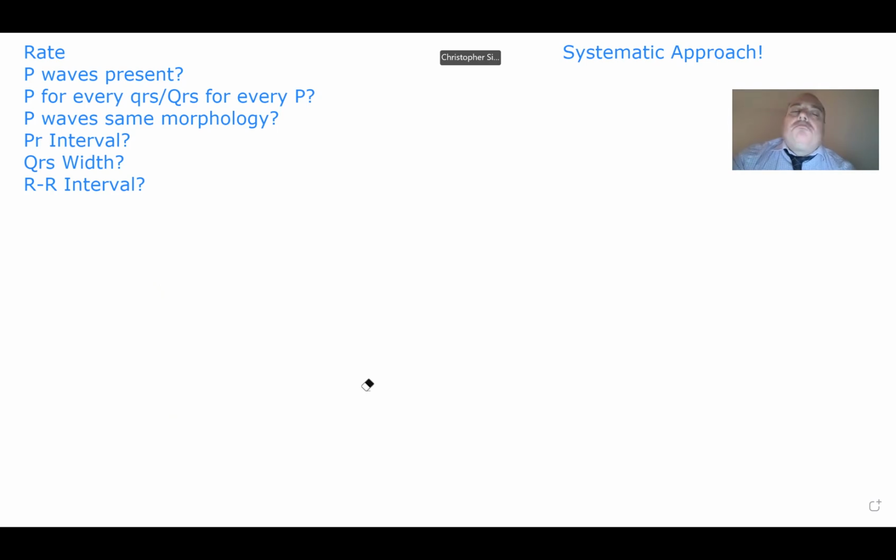So let's follow the same theme here, but let's look at something that's a little bit different, okay? So if we have something that looks like this.